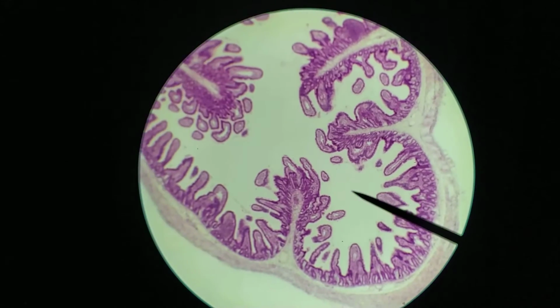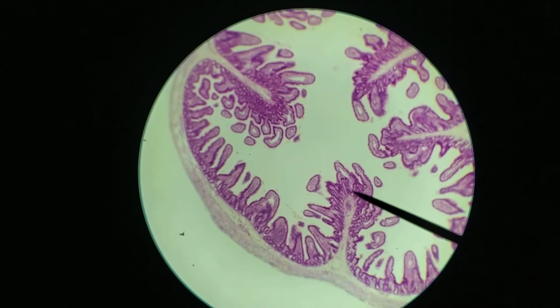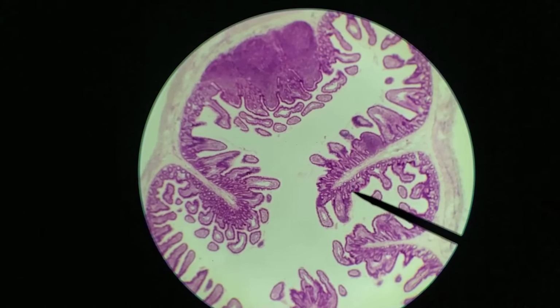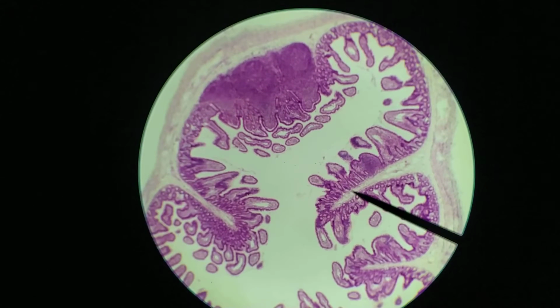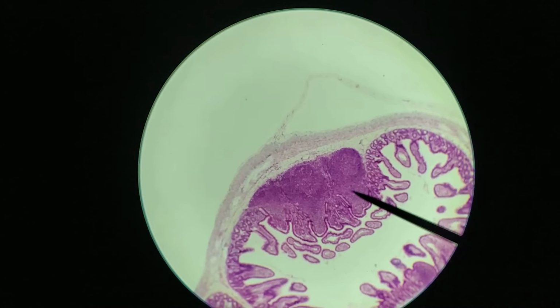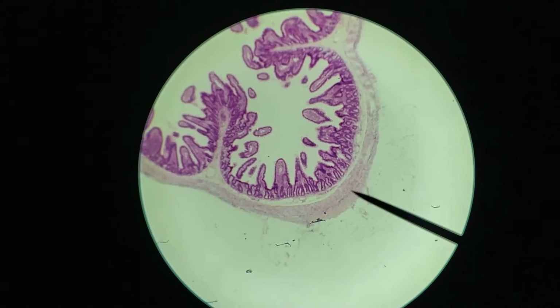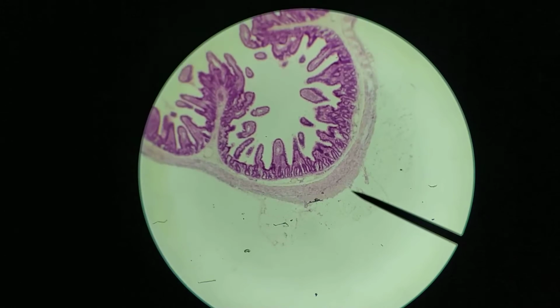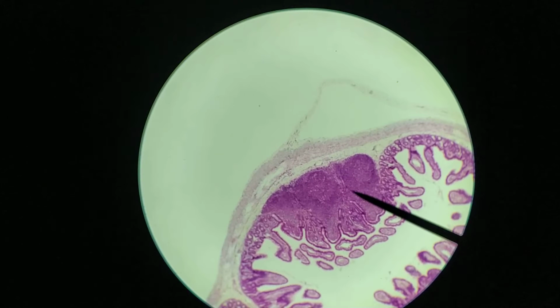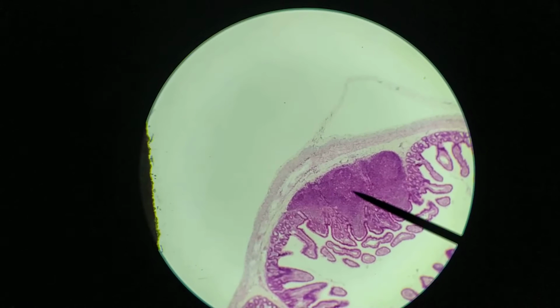Okay. Here are the valves of Kerckring, so those submucosal and mucosal folds that are permanent. They're quite prominent here. But the thing that will tell you you're looking at the ileum is this right here. This is a Peyer's patch. Okay. Let me see. It's been cut off here, so it's not going to be very easy to see. Okay. So right here is basically a cluster of lymphatic nodules.